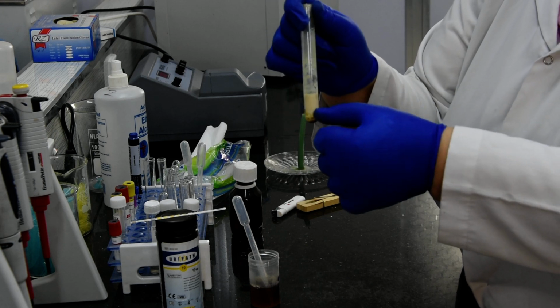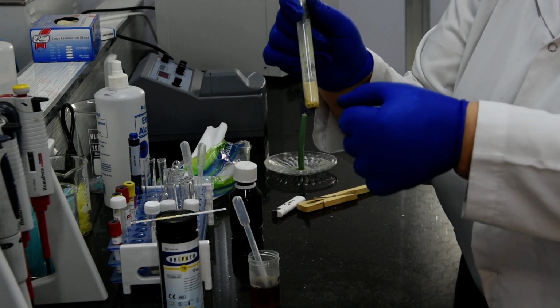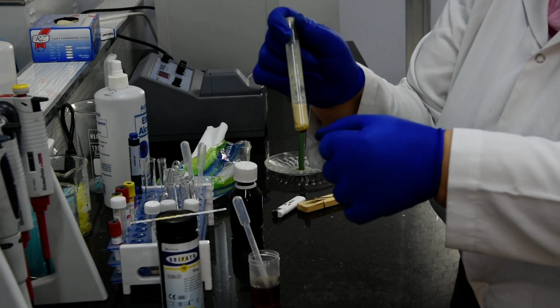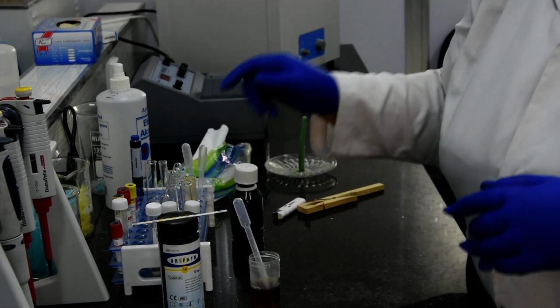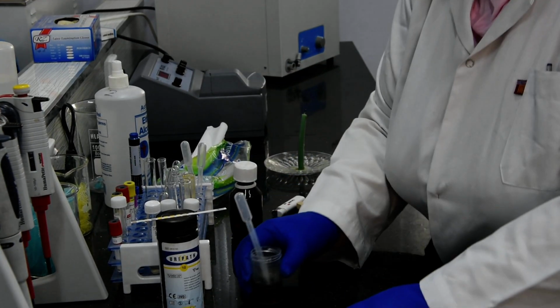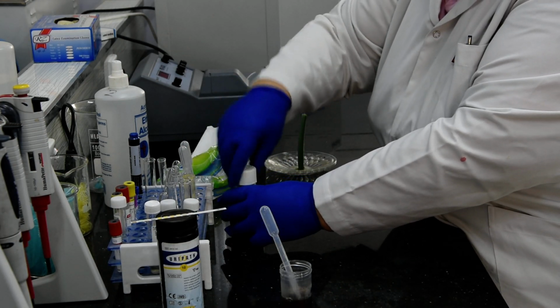Because if the turbidity or cloudiness disappears, that means it's phosphate. The phosphate is dissolved in hot acidic media. This is the first way to detect if our urine has protein or not, by glacial acetic acid.